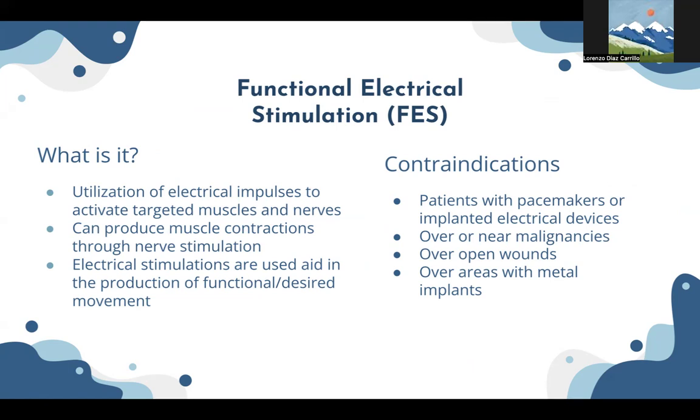But for this, contraindications: patients with pacemakers or implanted electrical devices, you don't want to do it over or near any malignancies. You don't want to do it over any open wounds or over any areas with metal implants either.